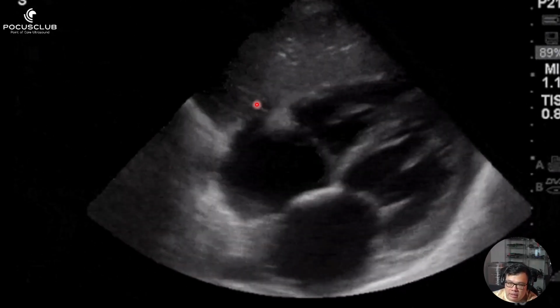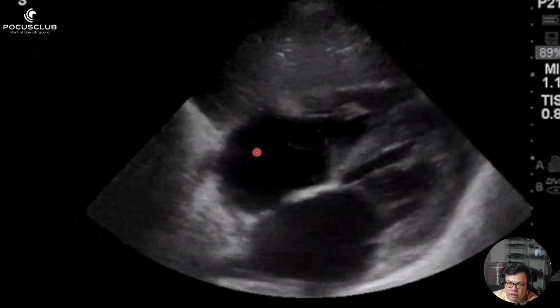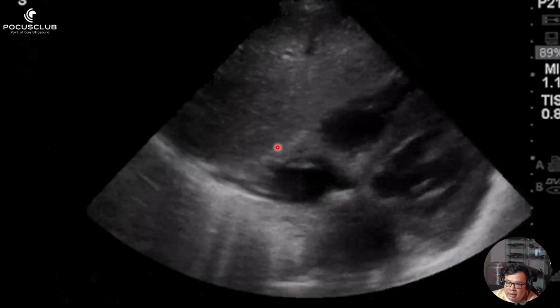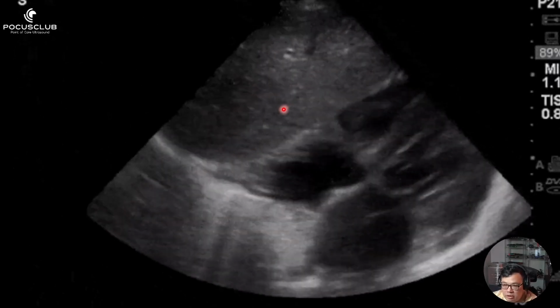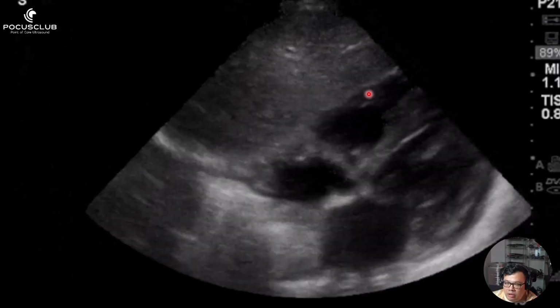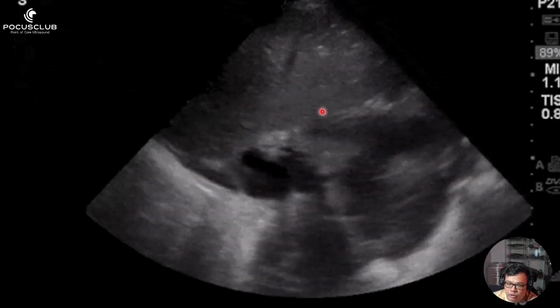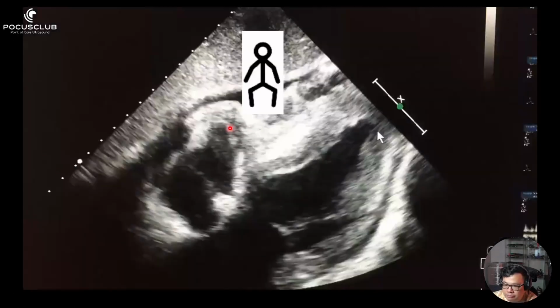You're looking to see whether there's blackness in between that and the myocardium, which would signify free fluid. And in this case, it'll be a pericardial effusion. Now, whether the patient is shocked, or looking very well, reading a newspaper: if he's reading a newspaper, the pericardial effusion is probably there a long time. If he's looking very, very bad, then it's likely that this small amount of free fluid or pericardial effusion is causing tamponade physiology. So go clinically by what the patient looks like.